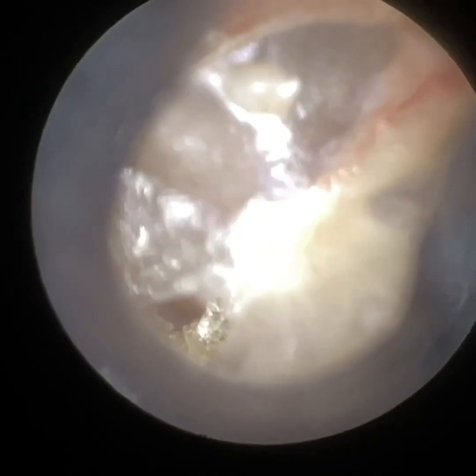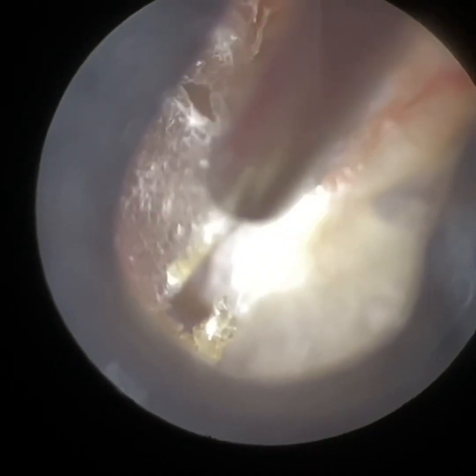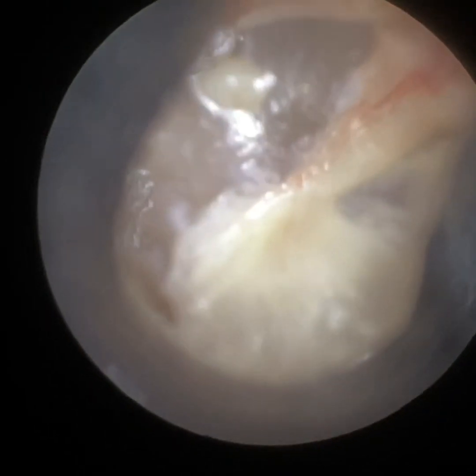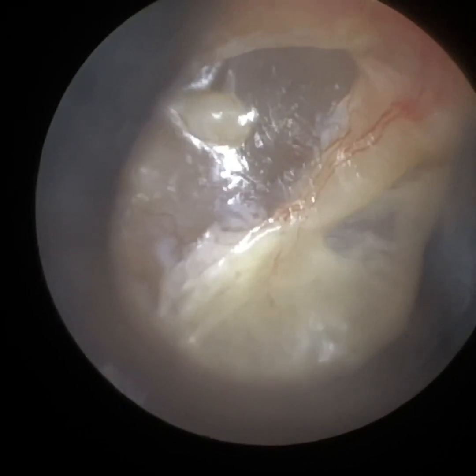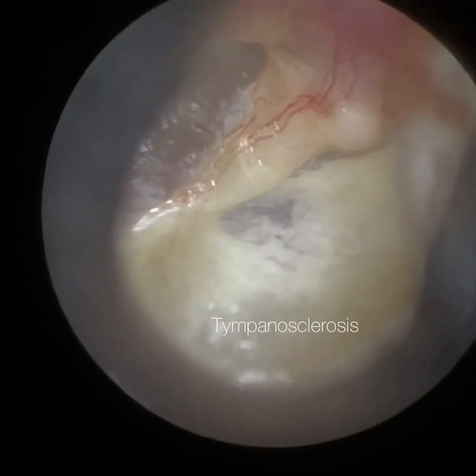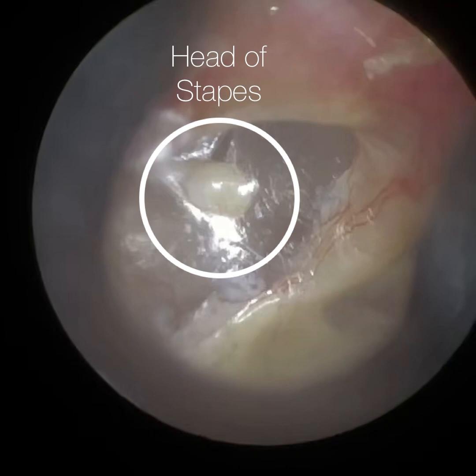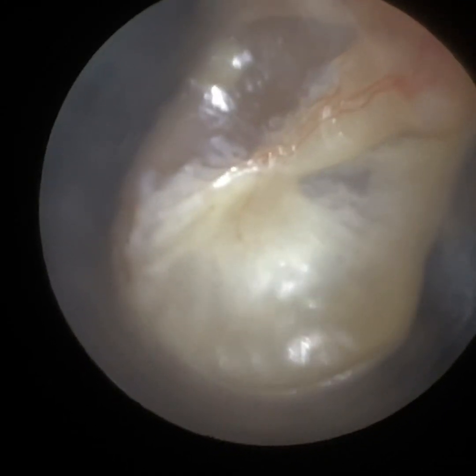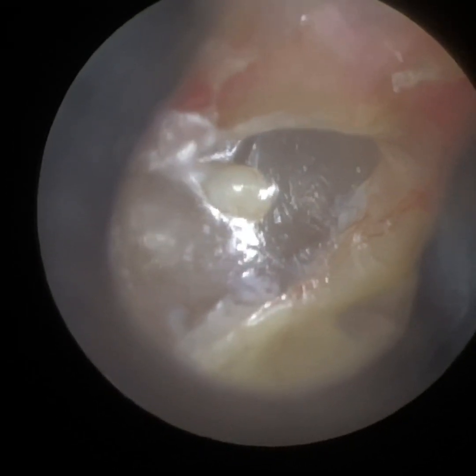I'm just going to adjust the brightness in a moment, because the patient's got loads of tympanosclerosis — scar tissue. You quite often have to reduce the brightness because you get a reflection from that, as it's white in colour. So we've cleared the debris, and I've just reduced the brightness there. Just to the left, that's the head of the stapes bone. And anteriorly — the front part of his eardrum — this is the tympanosclerosis, the scar tissue, just caused by chronic ear infection. So this is the head of the stapes bone that's visible, and posteriorly the eardrum's really retracted, hence why it's visible.